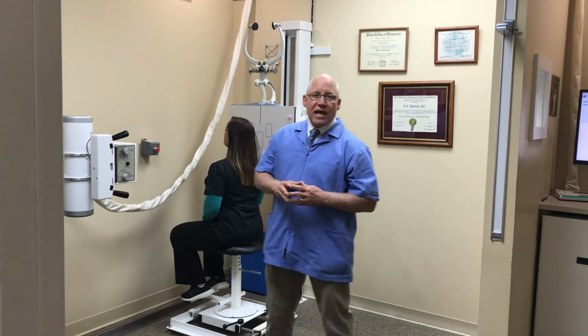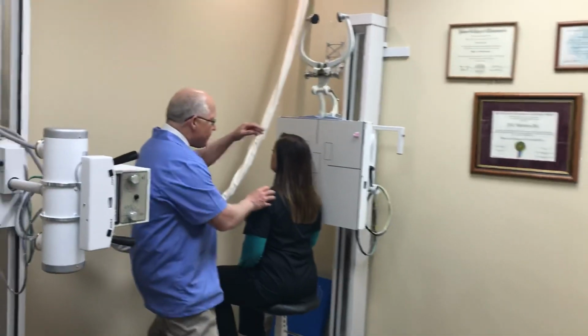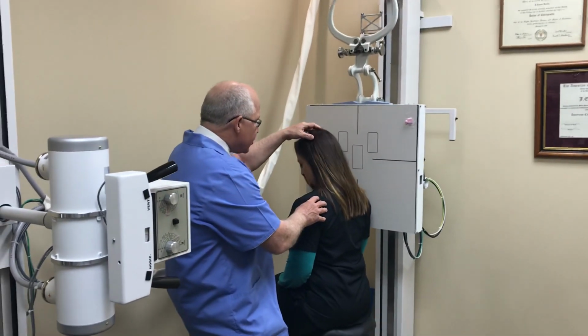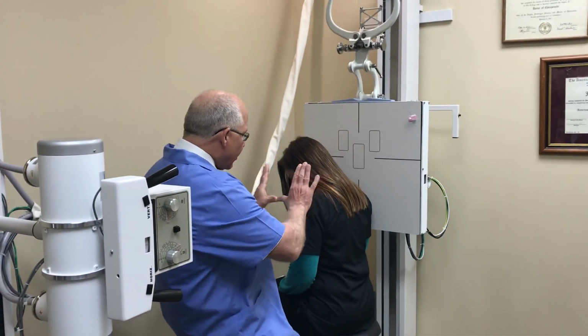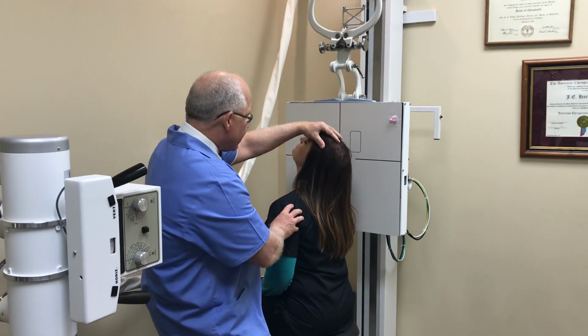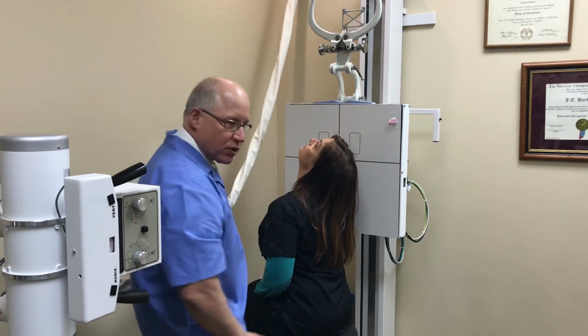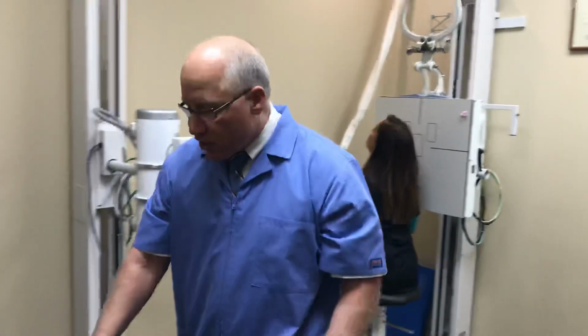So the first one we're going to look at is cervical flexion extension. So we're going to have Amanda tuck her chin down as far as she can, go like that. We're going to take an x-ray right here. Then you're going to look up at the ceiling, and that cervical extension, we're going to take an x-ray right here, okay? So now we're going to look at those x-rays.